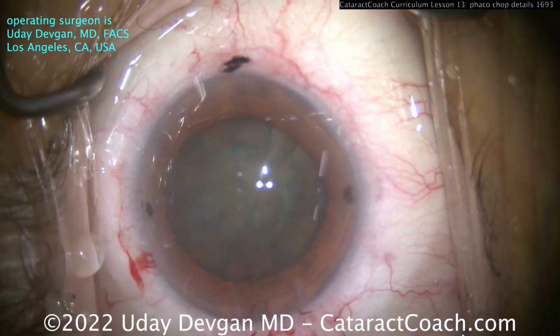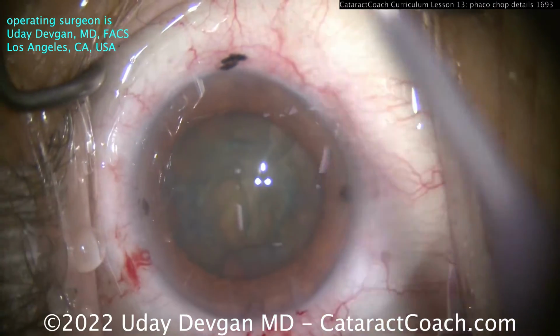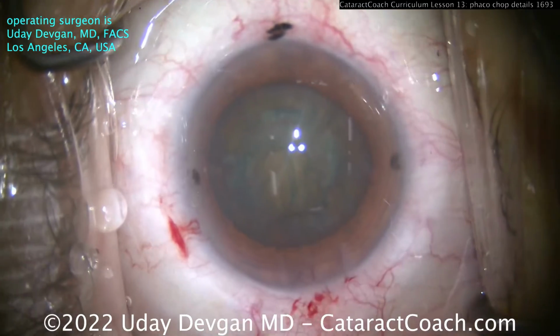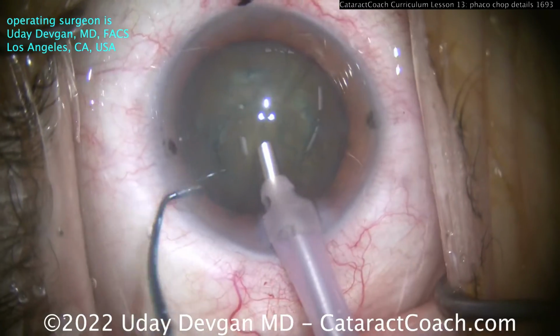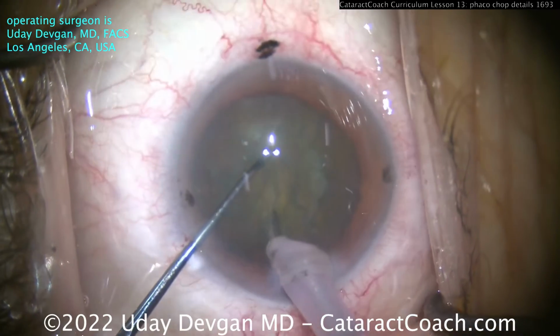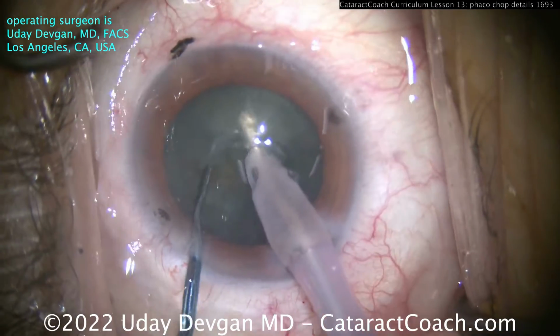Now here comes the one chop. We'll put a tiny aliquot of dispersive viscoelastic in that central cornea. Now I'm going to bevel down. I'm going to do a combo chop. And we're going to split the nucleus in two halves right away. So phaco probe goes in, chopper goes in. And now look as the chopper will help split the nucleus.